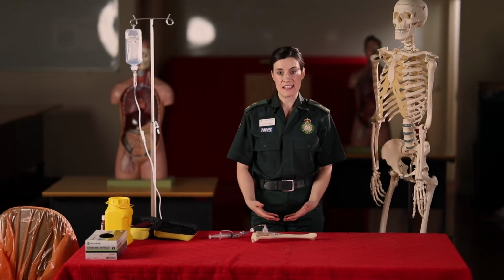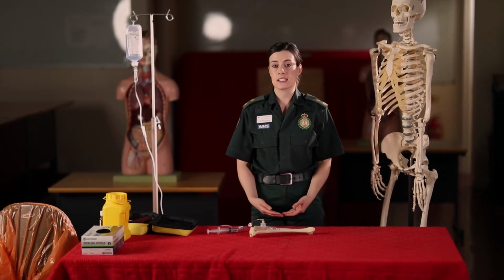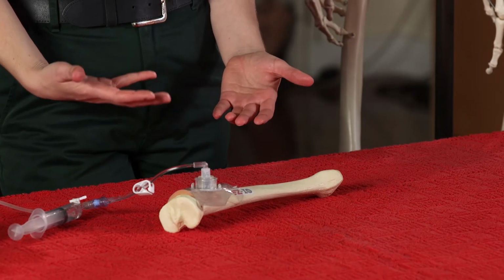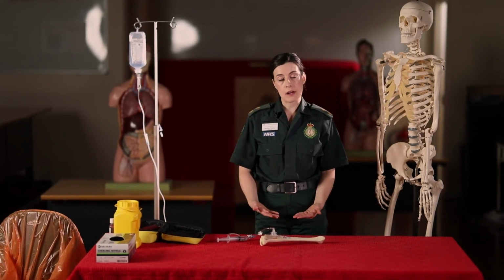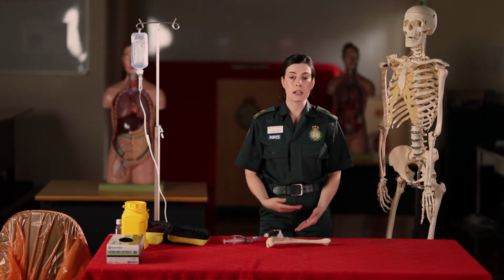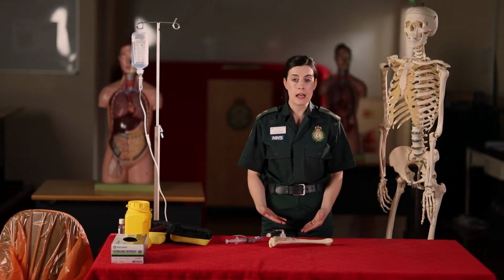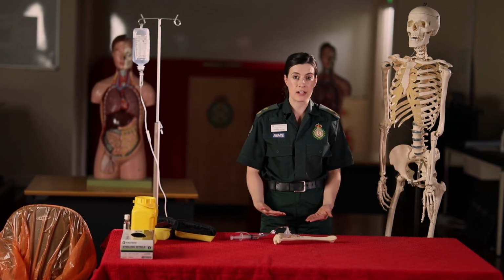After performing the EZ-IO and throughout its use, it's important to keep an eye on the site to make sure that it isn't tissuing and that your drugs are still flushing through properly. If the needle does become dislodged, it's important to then remove that needle and cover the site over with a dressing, making sure that you hand this over to any hospital staff or any other receiving clinicians.